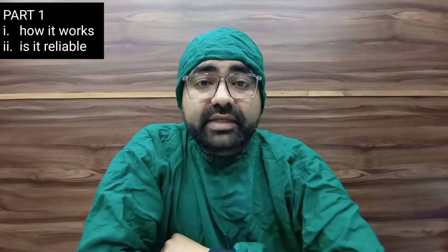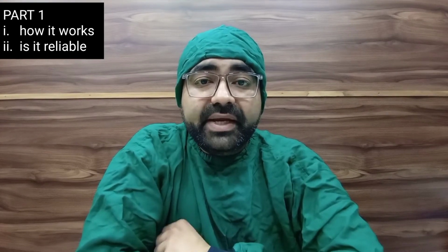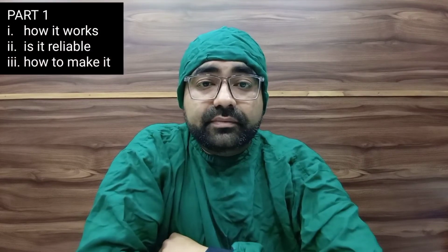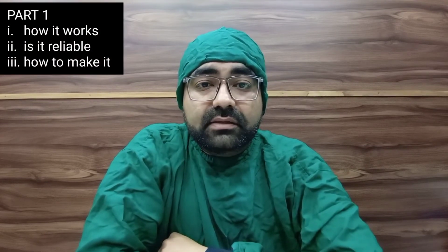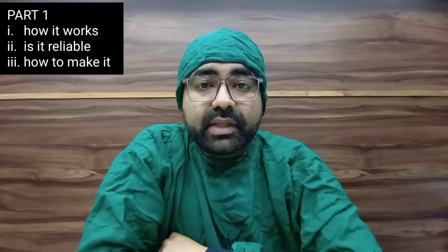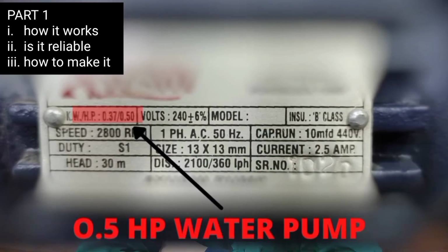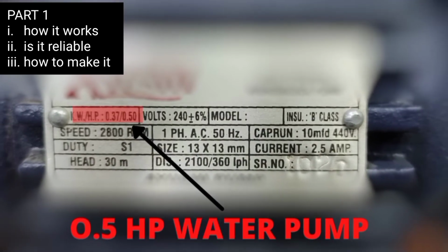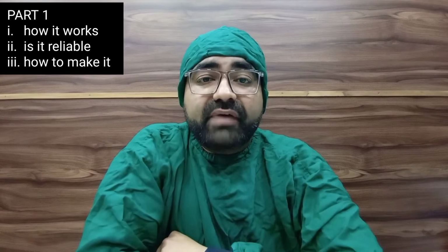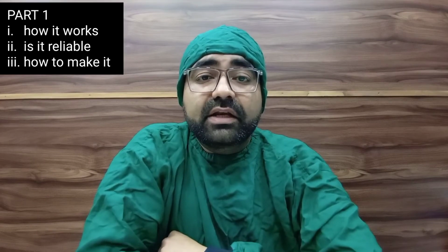This motorized suction is powerful and your assistant can switch it on and off repeatedly during the dental treatments and it will work fine. Now, how to make this motorized suction? To make this motorized suction, the main thing that you will need is a electric water pump. I would suggest for 0.5 horsepower electric water pump. 0.5 horsepower motor pump is the smallest size of the water pump that is available commercially, and 0.5 horsepower is more than enough for our dental use.